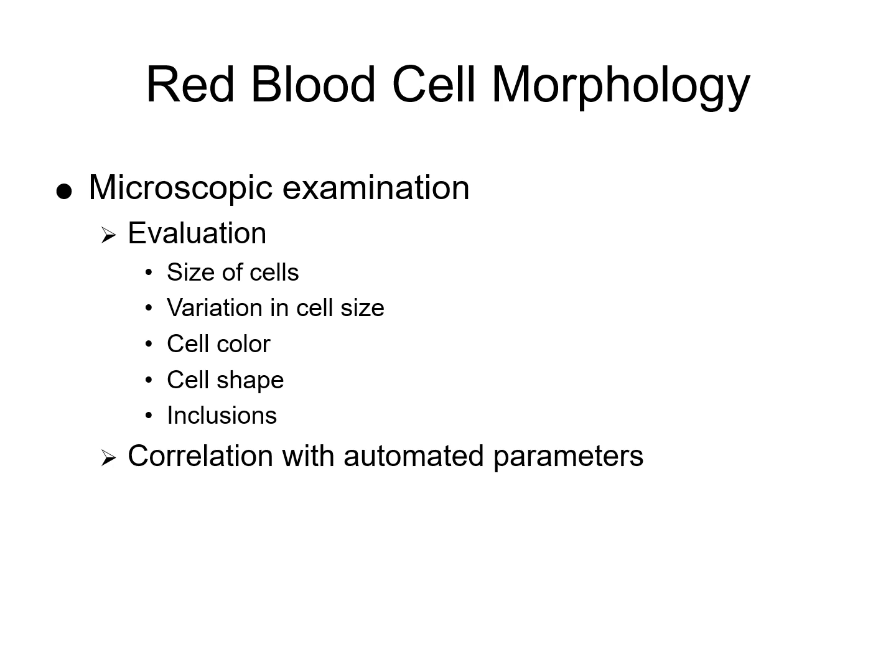We're going to look at cell color, or polychromasia and hypochromasia. Cell color reflects hemoglobin content. Hypochromic cells appear pale due to low hemoglobin, while polychromatic cells show a bluish tint indicating reticulocytes or immature red blood cells. We're going to look at the cell shape as well, which is called poikilocytosis. Abnormal red blood cell shapes such as target cells, teardrop cells, or even sickle cells can help identify specific hematologic conditions.